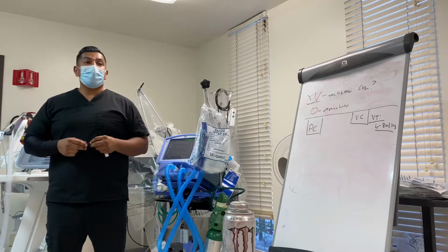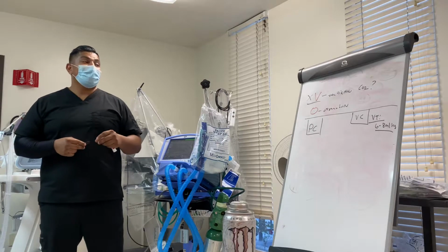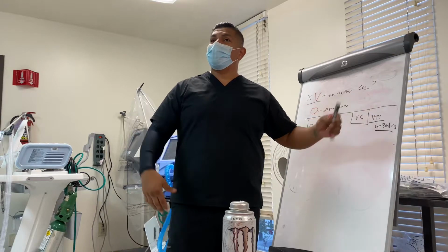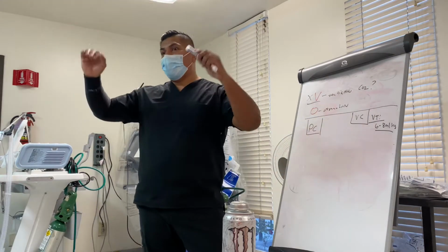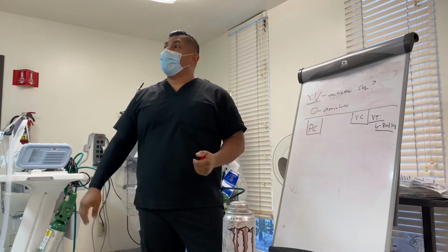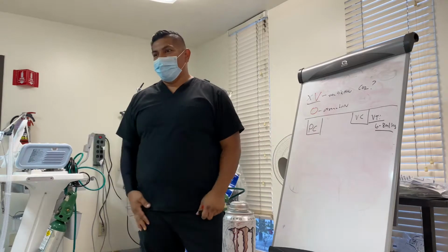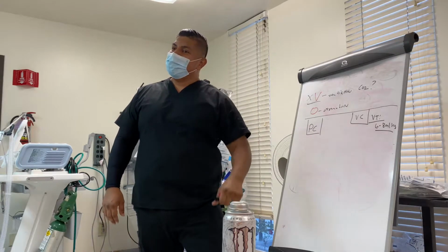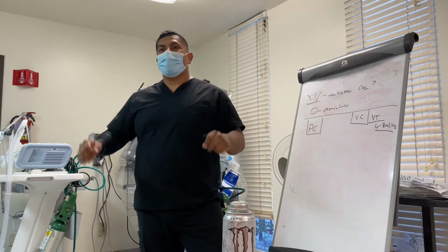They will not have any control over tidal volume, and if they have no control over tidal volume, they will not have control of their CO2, which will then affect their pH and so on. And if it's broke, and you show it to them, they are forced to fix it. Right. And what's the easiest way for them to fix that? Put them back on volume. Let's shear those lungs again.